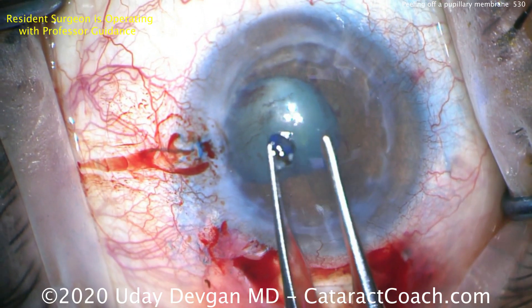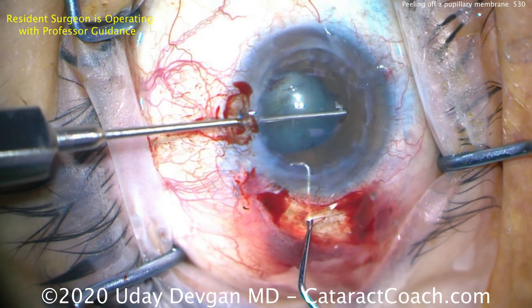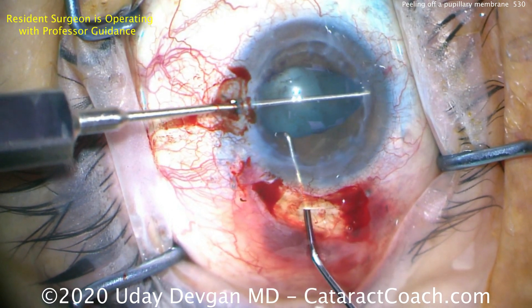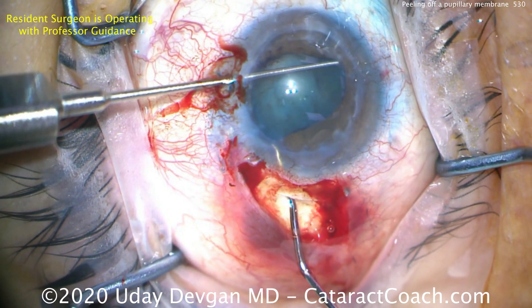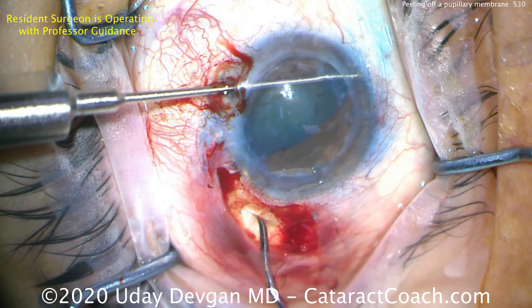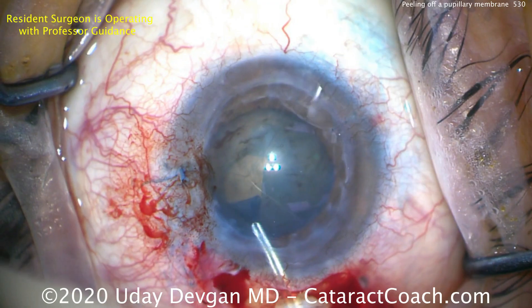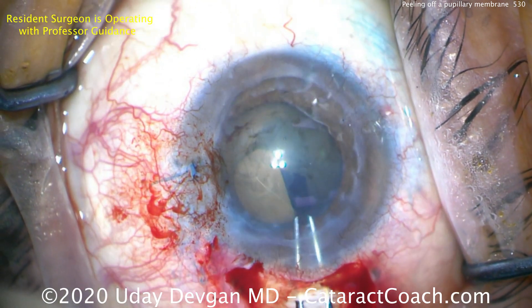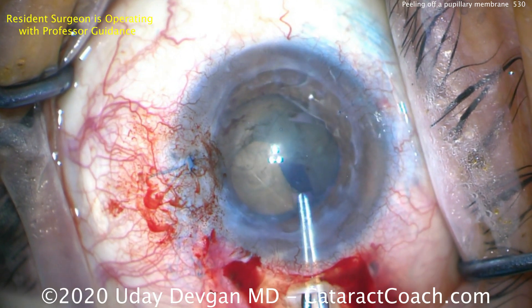There's the end of it — we've got it off. That's the balled-up pupillary membrane; we'll get rid of that. Now let's do a little pupil stretch — we don't need too much. Using two instruments, a chopper and an iris push-pull, we can push the pupil apart to get a little more stretch, then we'll do viscodilation. There's a good dilation of the pupil now.